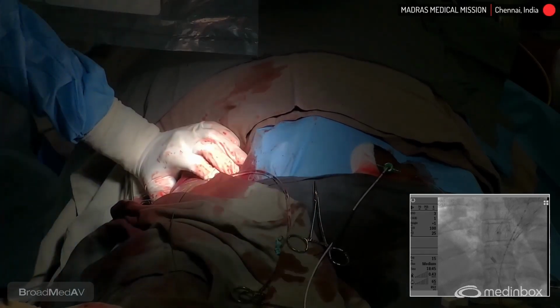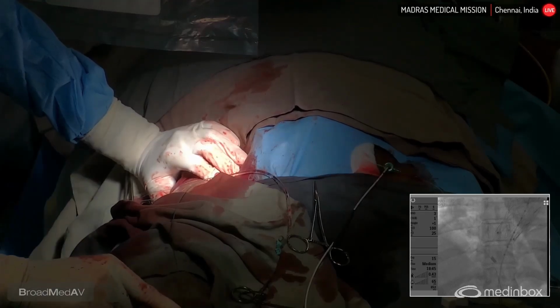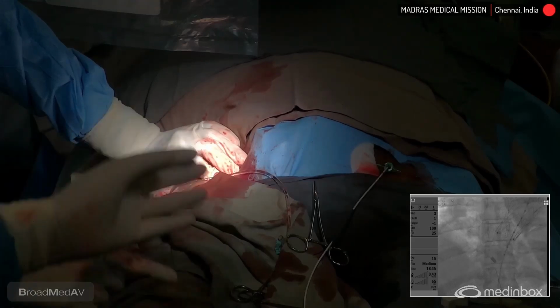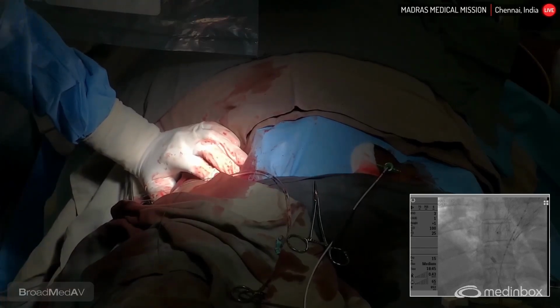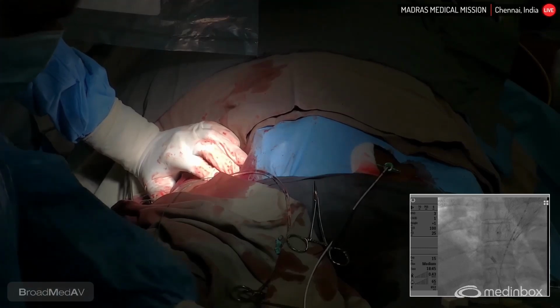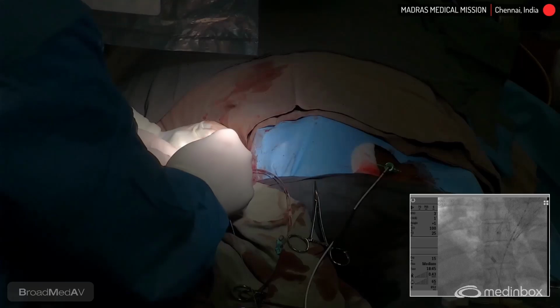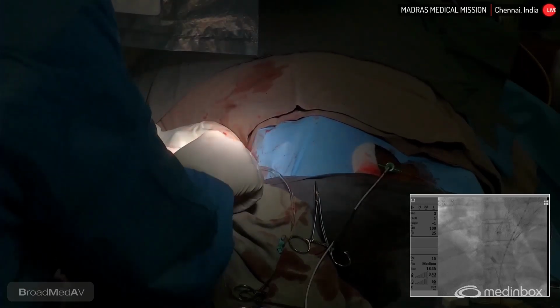Shall we put 2 angioseals in this particular case? We will make this wire into 2. And I will put 2 angioseals because 2 proglides got cut. No, the hole is big, it won't. So, yeah, you put this angioseal wire through this. Oh, the 8 French. I think it's a bigger size.